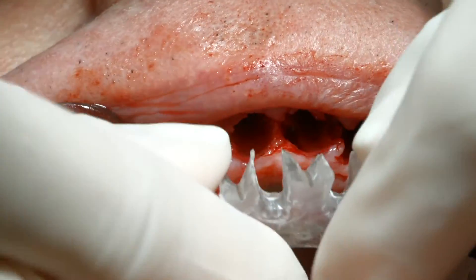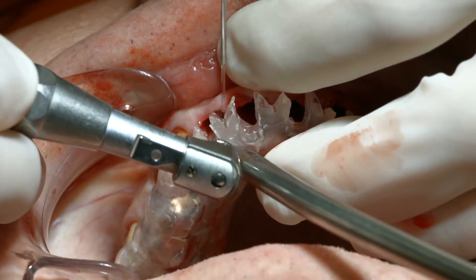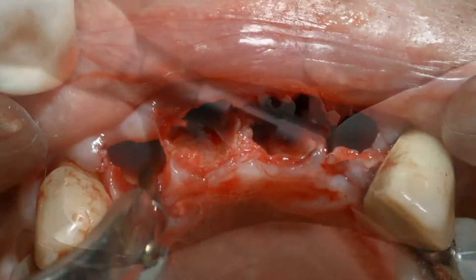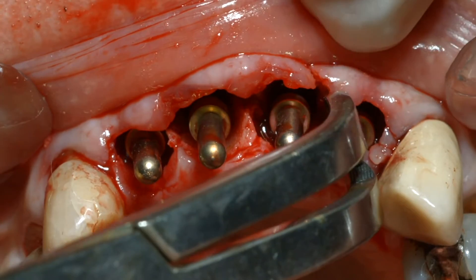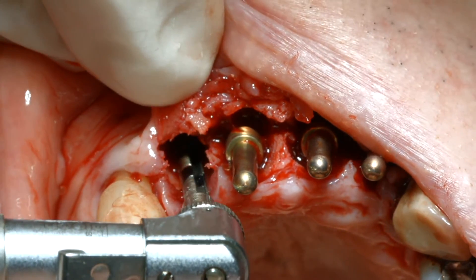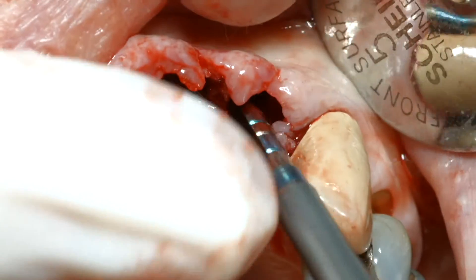The clear surgical guide was inserted and used to facilitate the positioning and drilling of the 2.0 mm pilot osteotomy. After the initial preparation, gold-colored paralleling pins were inserted into the osteotomies to confirm their trajectories prior to further incremental widening of the osteotomies with latch and hand reamers.